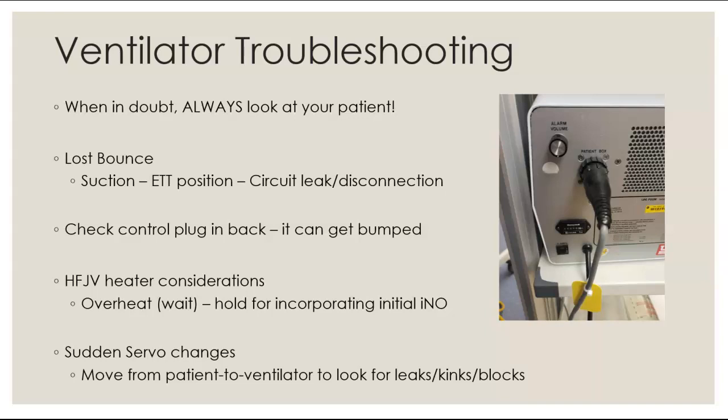You also would hold if we are incorporating inhaled nitric oxide, because otherwise it will cause water to go into your circuit, and then you could potentially lavage your baby, and that's not good.